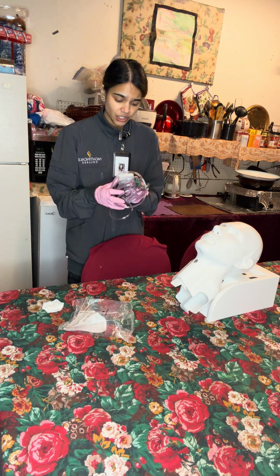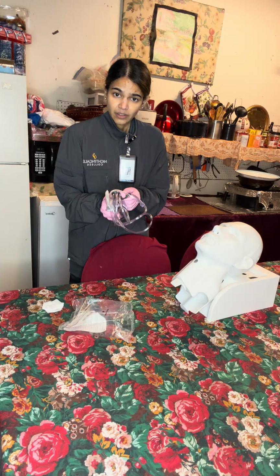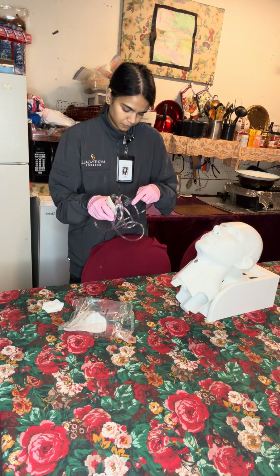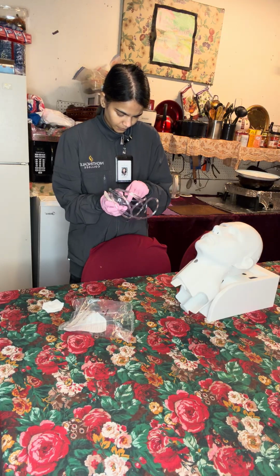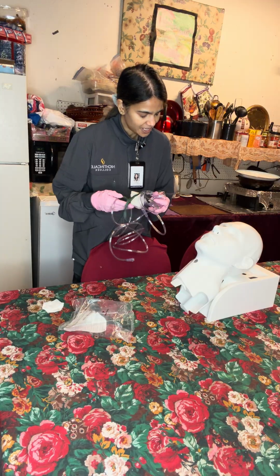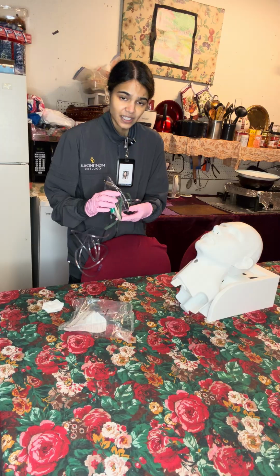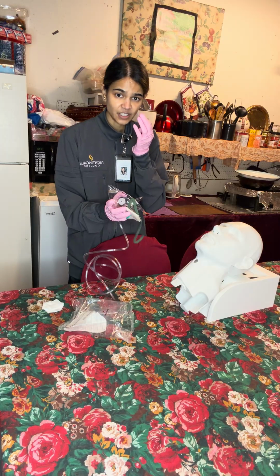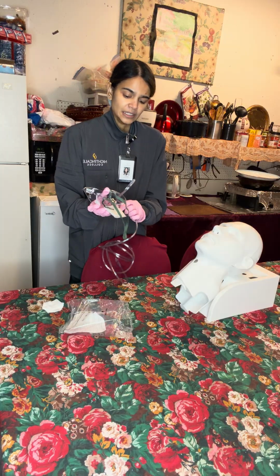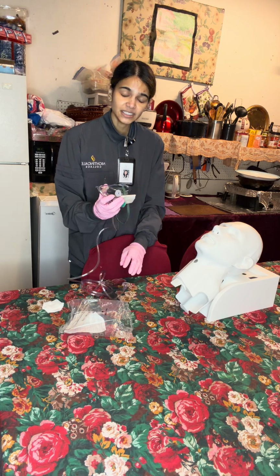I will let the patient know that the doctor has ordered higher levels of oxygen. Your oxygen levels are still on the lower end, and the doctor has prescribed for you to wear an oxygen mask. The oxygen mask covers the patient's nose and mouth and ensures greater oxygen coverage. For simple oxygen masks, the flow rate can go from a range of 6 to 10 liters per minute.